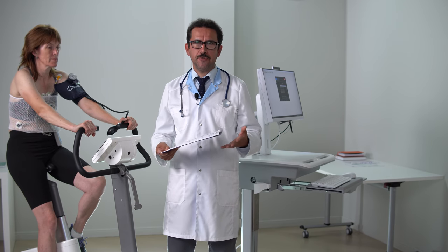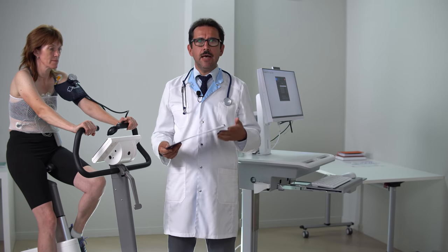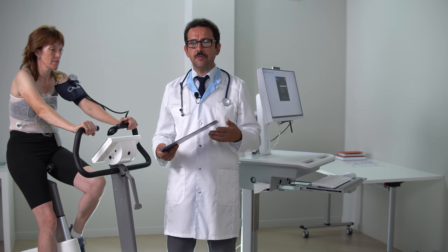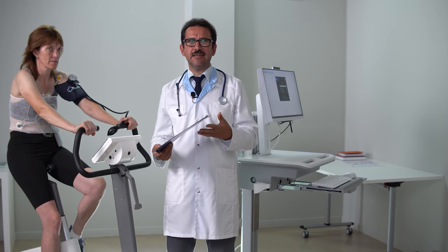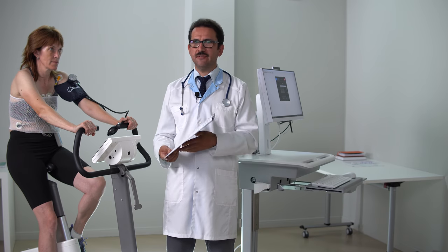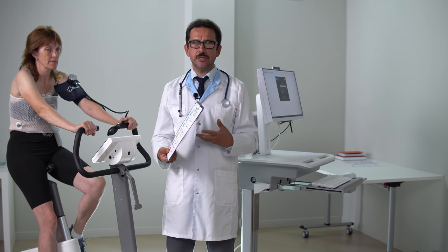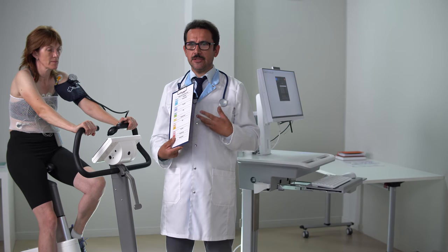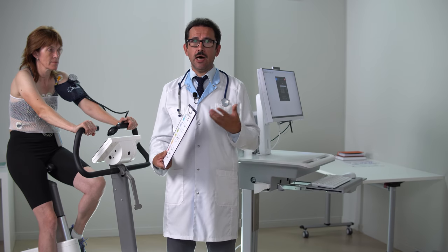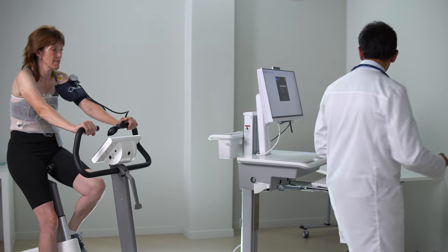We may have two different exercise stress tests with the same heart rate, with the same exercise level, but different patient's feeling. So, for example, in the second test, the patient says, okay, I'm feeling that the exercise is much higher than in the first one. When we see the objective parameters the same, what does it mean? It means that during the period between these two tests, patient's condition deteriorated and he feels that this exercise is more challenging for him. So our therapeutic measures may be wrong. Or vice versa.